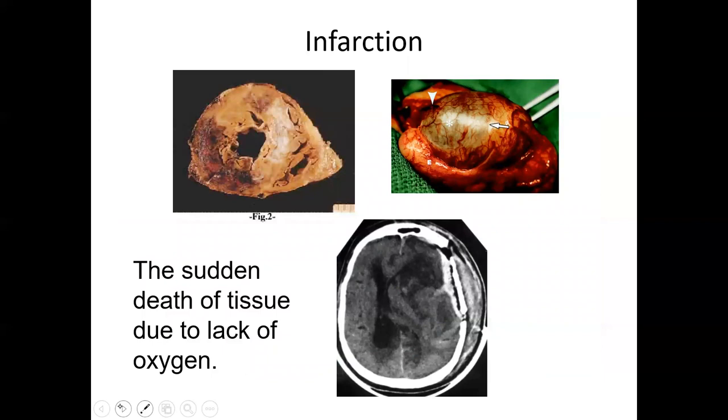Here's an infarction. Now, in an infarction, tissue dies suddenly due to lack of oxygen or circulation. Cerebral infarction due to the skull injury. This is a myocardial infarction, or a heart attack. Actually, this is multiple infarcts.